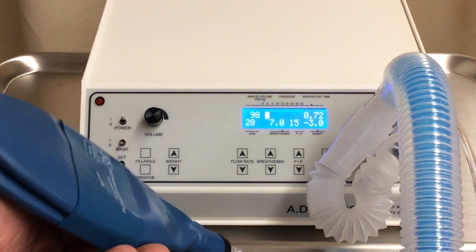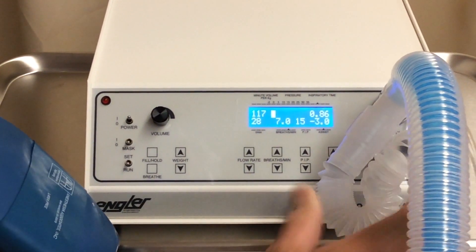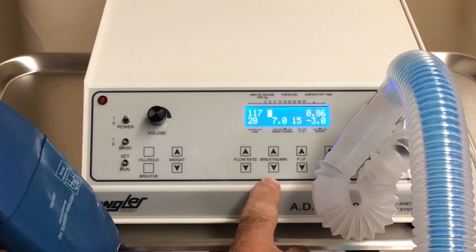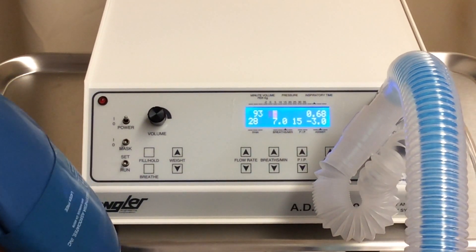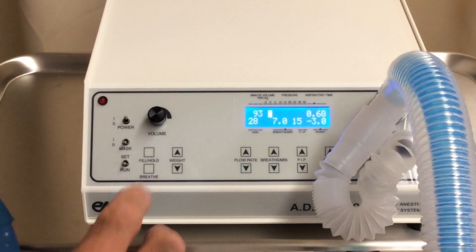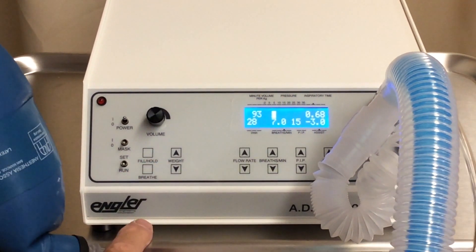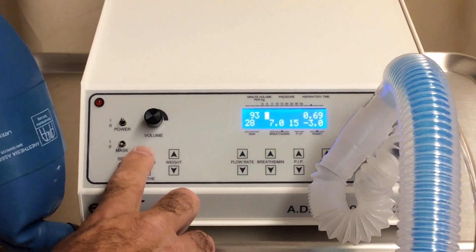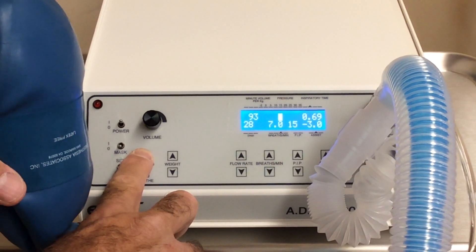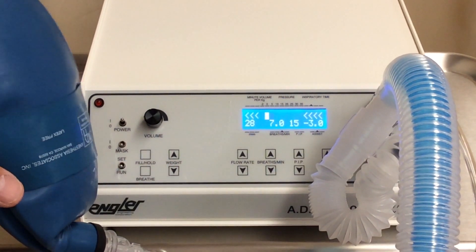If you need to change any of the breathing parameters, you can do that manually at any time. You have the flow rate, breaths per minute, and peak inspiratory pressure, which can be changed anytime during the surgery. We have a breathe button, which allows you to manually deliver a breath anytime. We also have a fill and hold button, which will fill and hold the lung to the peak inspiratory pressure you have set and maintain it until you let go of the button.